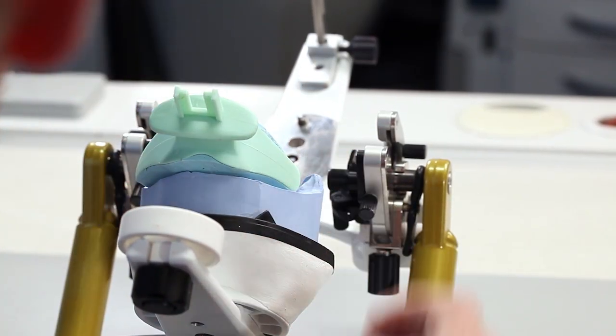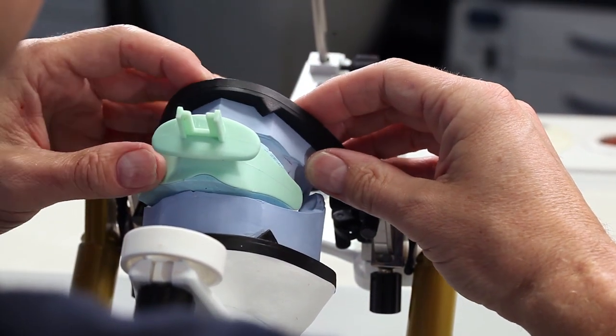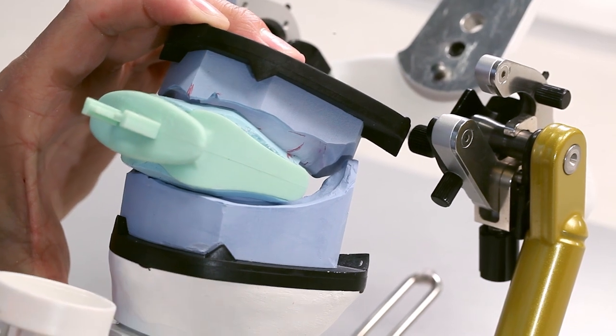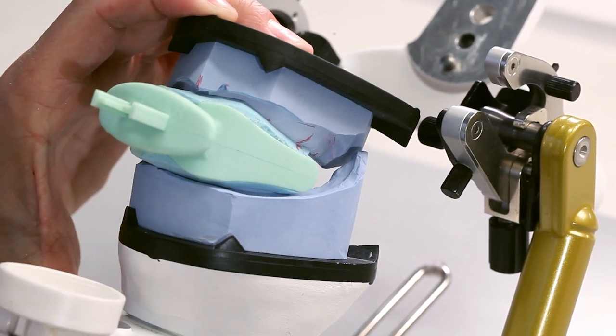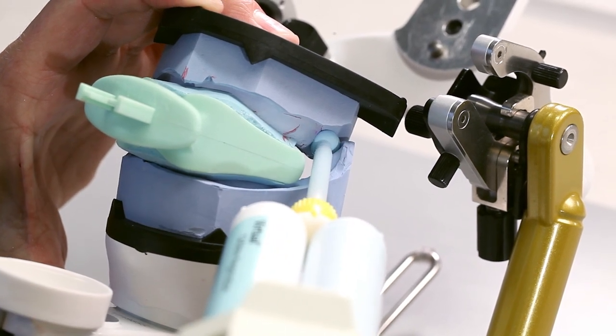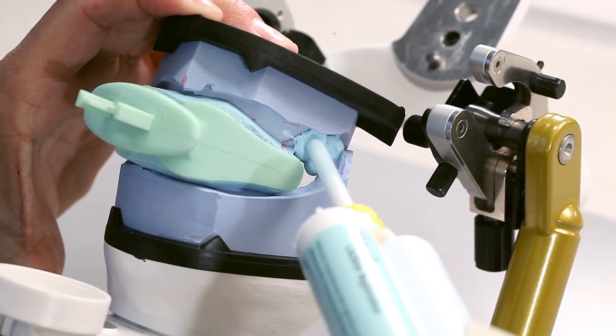Reposition the centric tray and check the fit together with the maxillary model. The markings simplify the aligning of the parts correctly. Once the maxillary model has been secured with sticky wax or silicone, it can be articulated. If the models are extremely moist, use a fast-setting silicone.